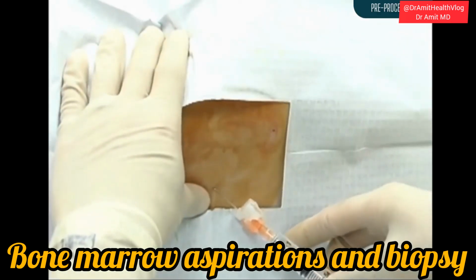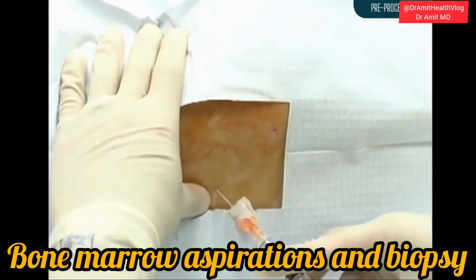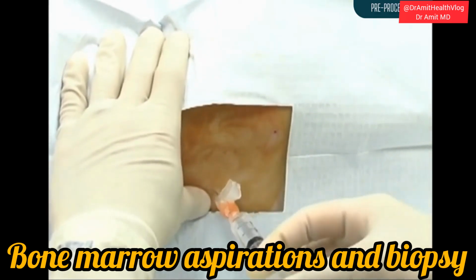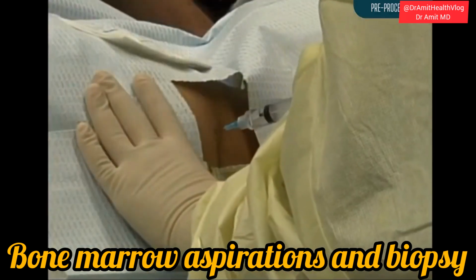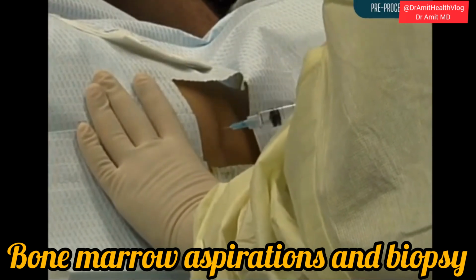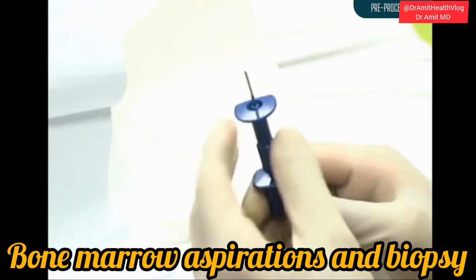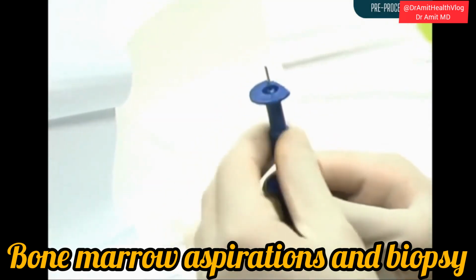After sterile preparation, 1% lidocaine should be slowly injected to raise a wheal over the biopsy site. Then, infiltrate the periosteum with 2 to 5 milliliters of buffered lidocaine. In the awake patient, ensure the adequacy of local anesthesia by gently tapping the periosteum with the tip of the needle used to deliver the anesthetic. Inspect the bone marrow aspiration needle and remove the plastic guard if one is present.